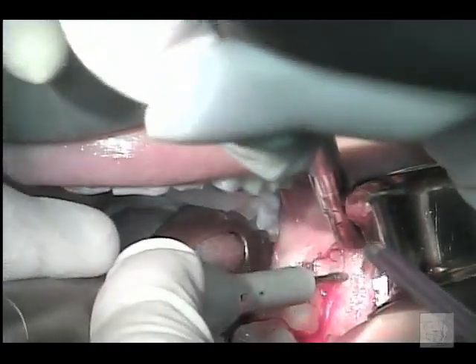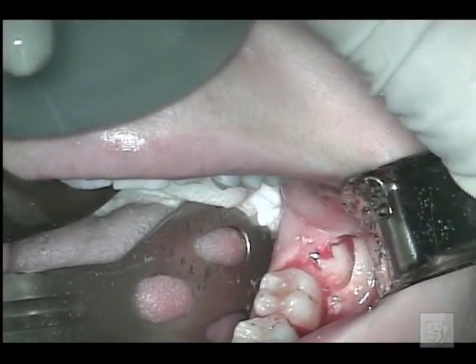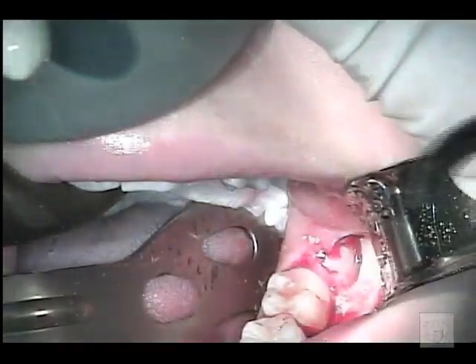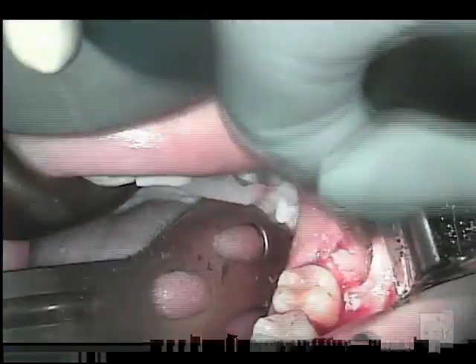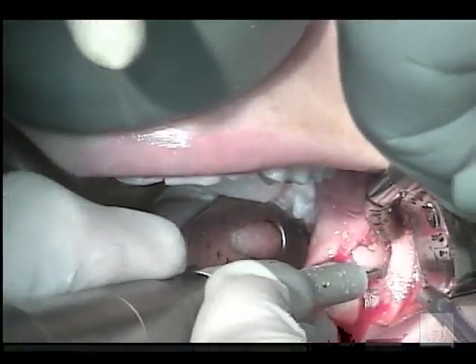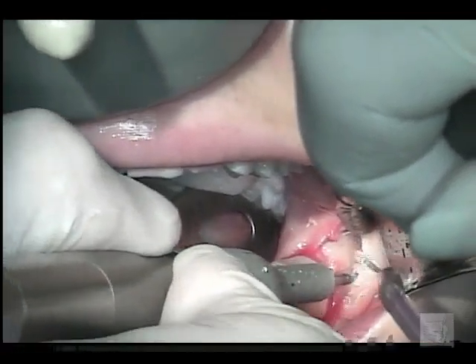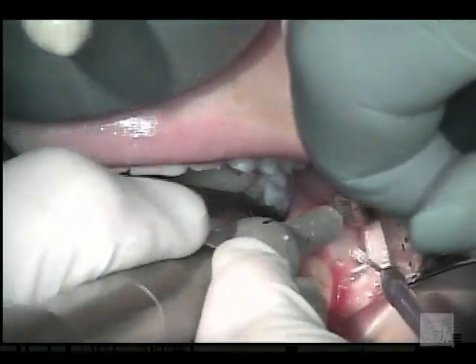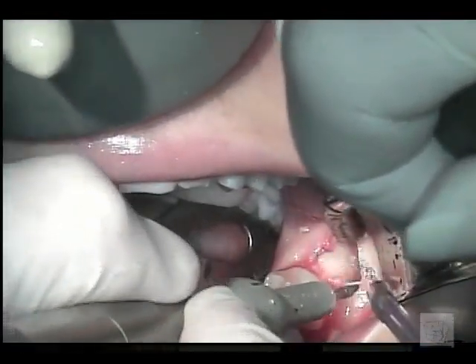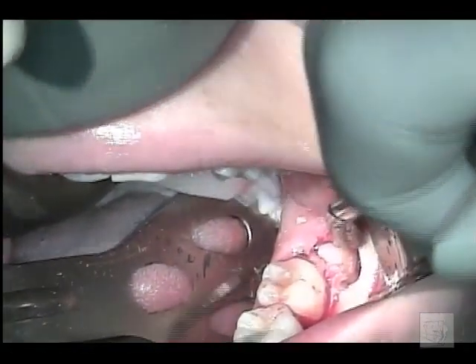And then we take our handpiece and we remove the bone that's in the way. And a trick that I learned in my first year of residency, actually in my first week of residency, is that tooth enamel is much denser than is bone. And so if you take your handpiece and with very gentle pressure, lay it against the crown and just sweep it back and forth, you'll end up removing bone and leaving the crown of the tooth fairly intact.